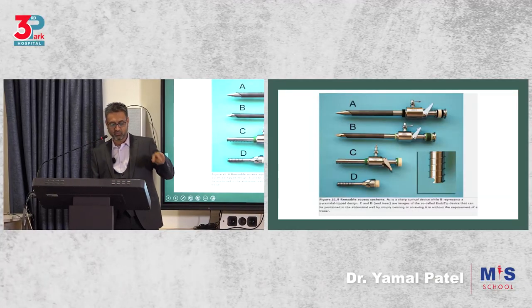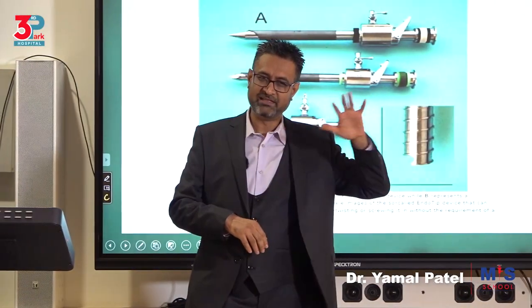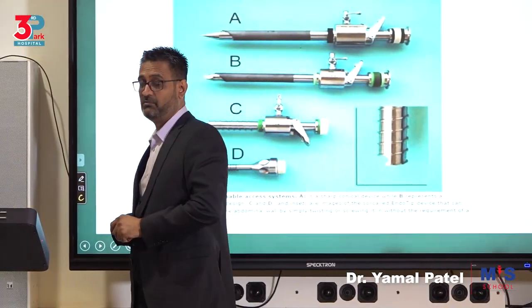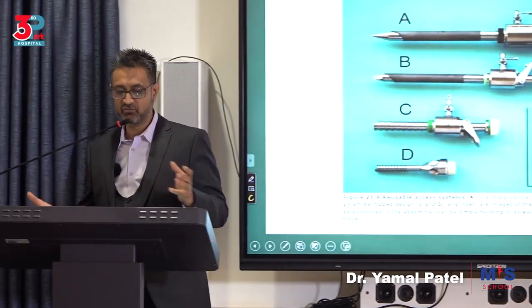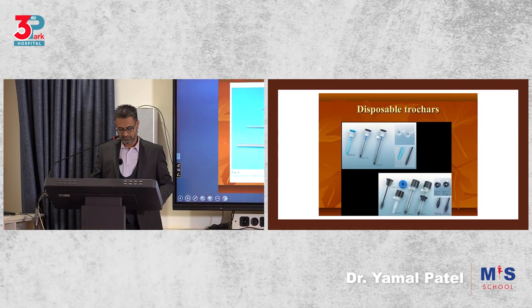Then you have the threaded ones, which are used so that you get less slipping. And then you have the disposable ones, which are single use, and they are various types as well. So these are some disposable ones, for example.